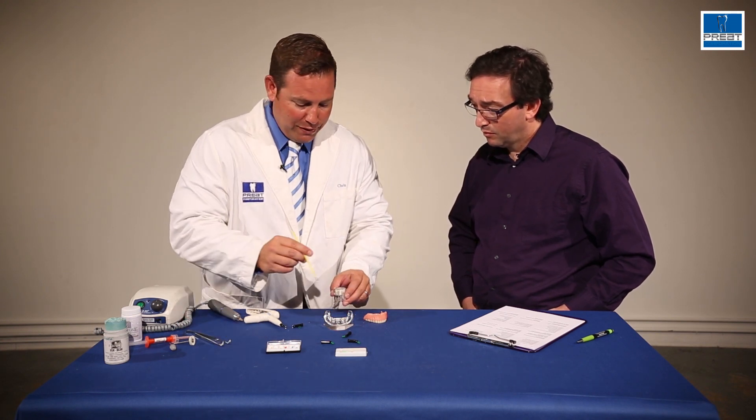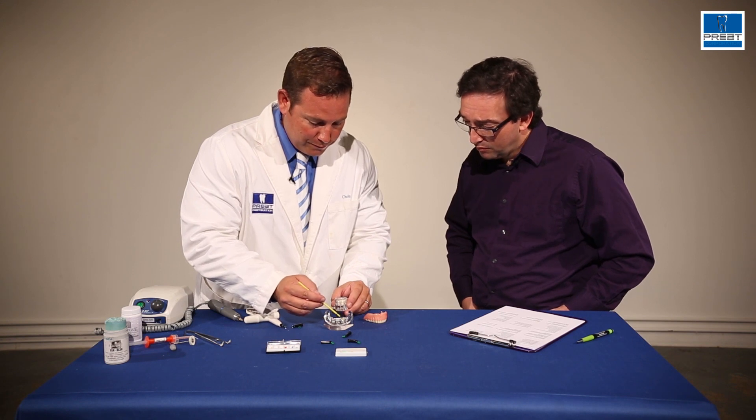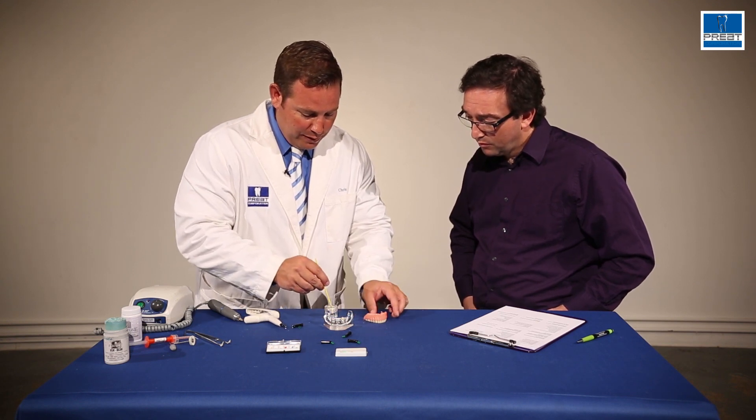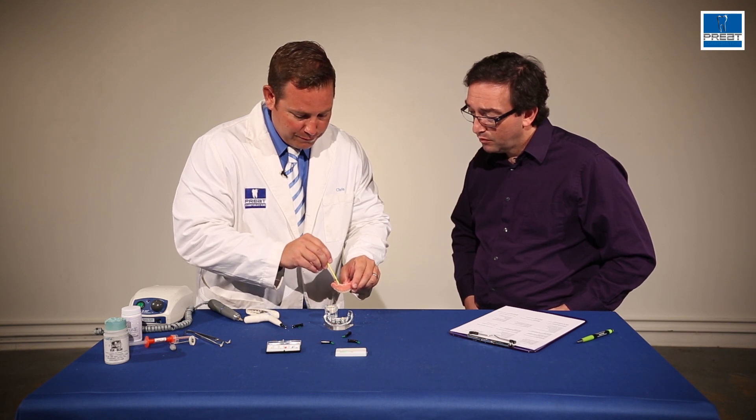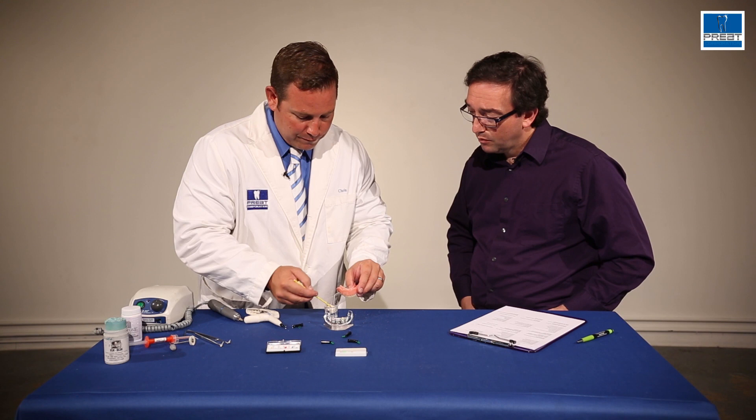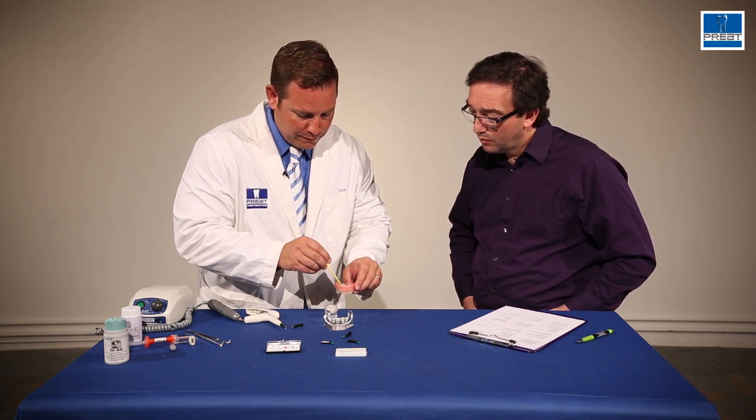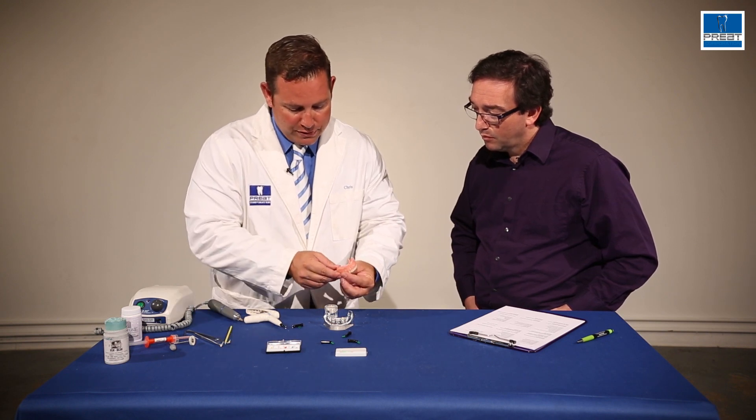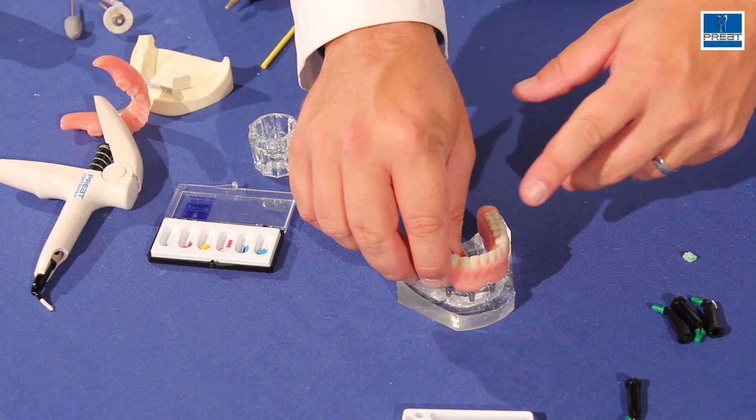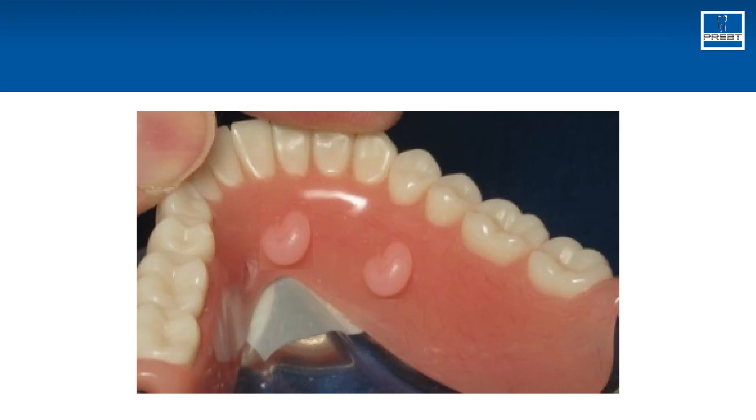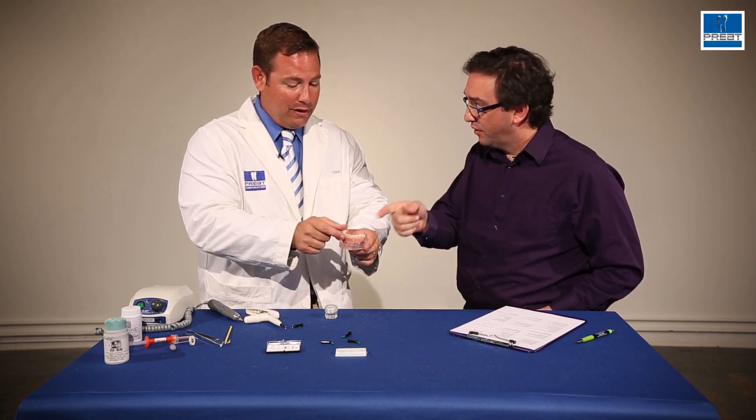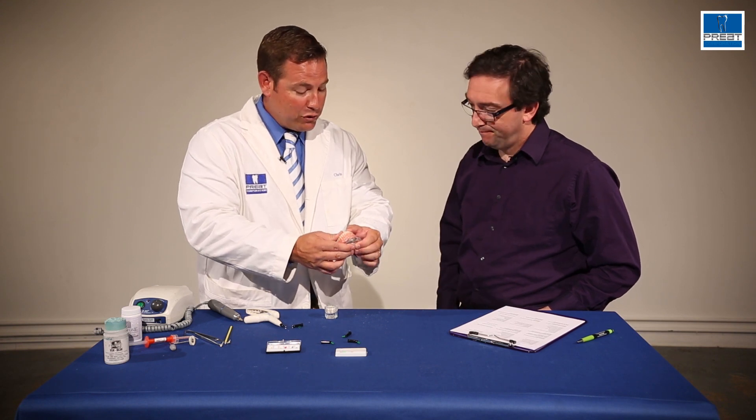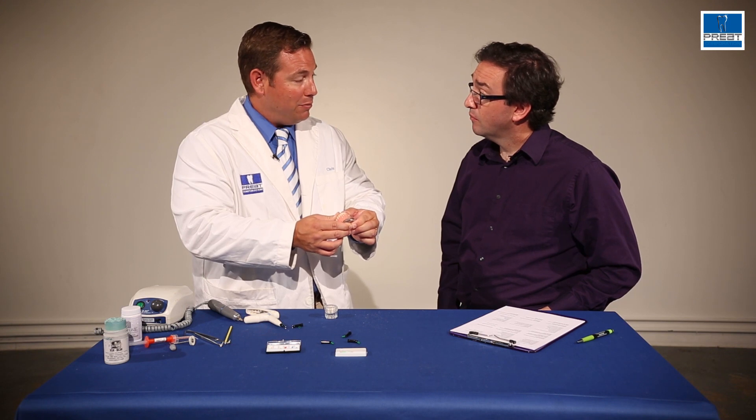Now it looks like our acrylic is ready. What I'm going to do is put a little bit here on top of the housing. Then I'm going to paint a little bit inside. Put a little dab here inside the denture. You can notice it's got a nice, doughy consistency here. So when I seat this down, if I'm working in the mouth chairside, I want to snap it into place. You saw the excess acrylic come out through the escape. Absolutely. So the big thing is, I don't want to have the patient come into full occlusion in the posterior. On a case like this, if you compress the soft tissue back here, then it's going to ruin the housing at the front. But if we keep finger pressure over the attachment area while this cures, it'll hold the attachments into place and eliminate that movement.